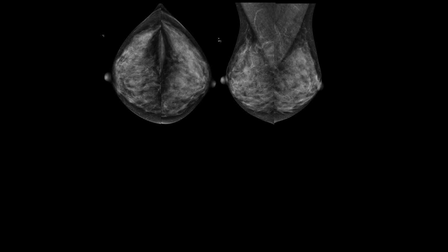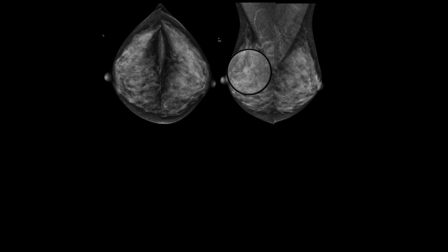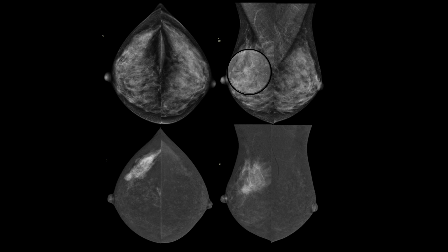Number one scenario is patients who are called back from abnormal screening. In my institute, if we identify a lesion that looks suspicious enough on screening mammogram, or even on the background of dense breast like that, we book the patient for contrast-enhanced mammography upfront, anticipating that this is probably going to be positive. And of course, we can see that not only is it positive, but also it is way more extensive than we would imagine with the standard mammogram exam.